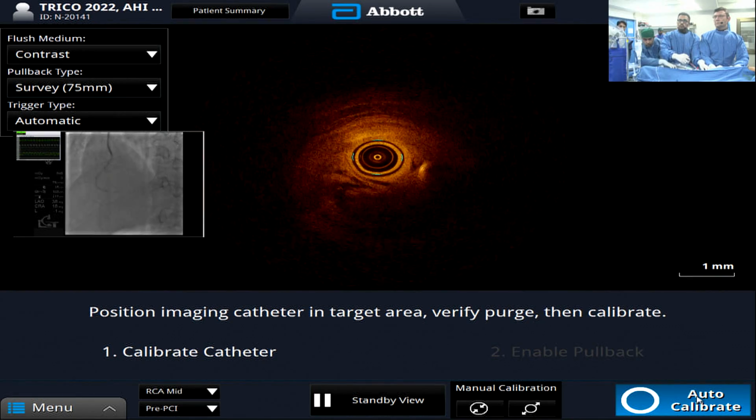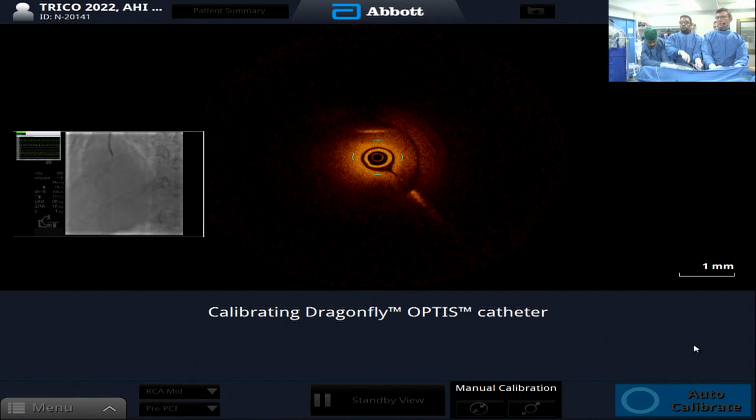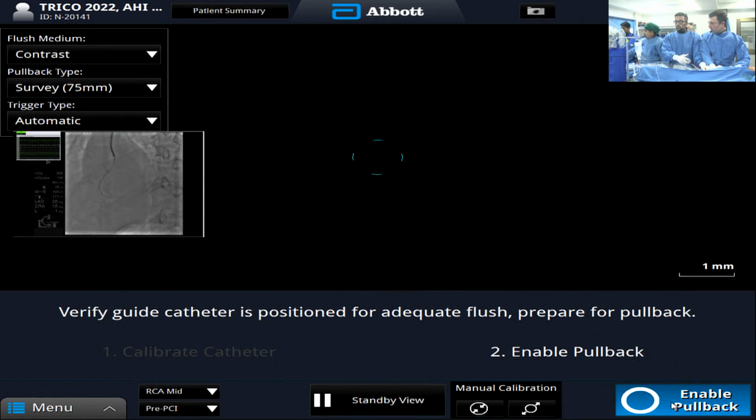Yes, please. You might want to come back a little. Yeah. Come back a little bit. Yeah. There, right? That's the right size. Okay. Pressure is good. Yep. Pressure is good. Everything is good. Okay. Are we ready? Yes, automatic.